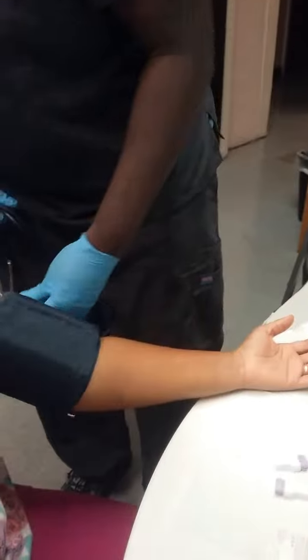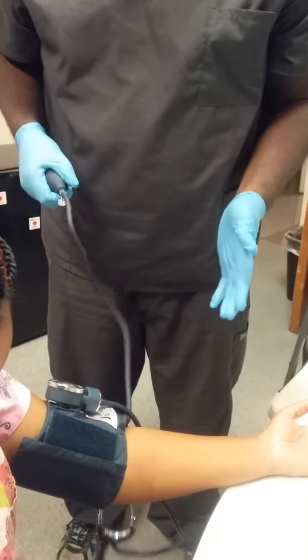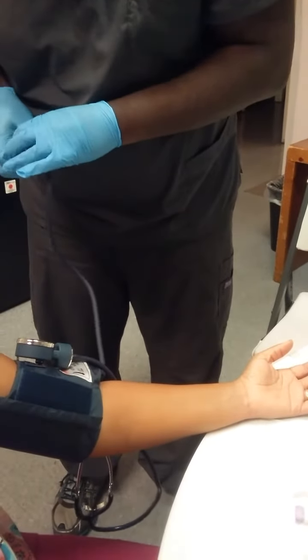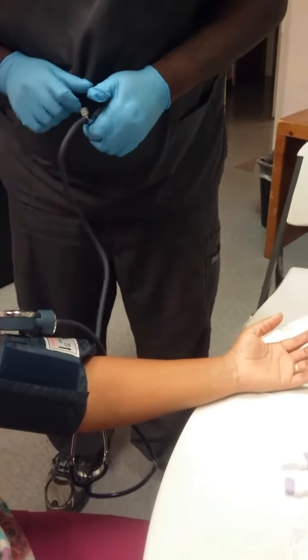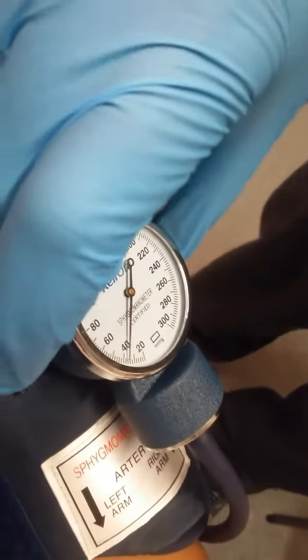Now it's in place. The next thing we want to do, we rotate this device up, gauge up so we can see. Now we want to increase it to 40 millimeters of mercury, because that's what we need for this procedure. As you can see, we're at 40 millimeters of mercury, which is what we need for this procedure, pretty much.